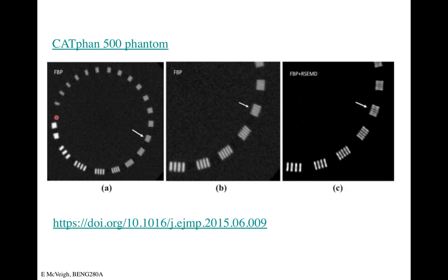So here we see a pattern of these lines, with cycles per centimeter and cycles per millimeter, and you just look around, make plots, and see when the contrast drops down to zero. That's one way of measuring spatial resolution. You can see that they're all at the same radius. The spatial resolution we're testing here is the resolution with respect to changing theta. We don't have it as a bar, looking as a function of r from the origin. It's theta as we're going out here.